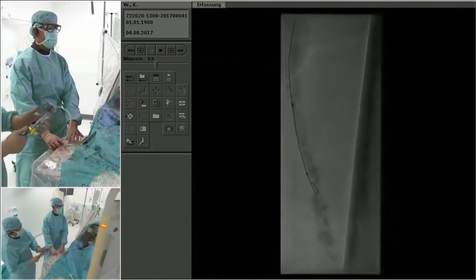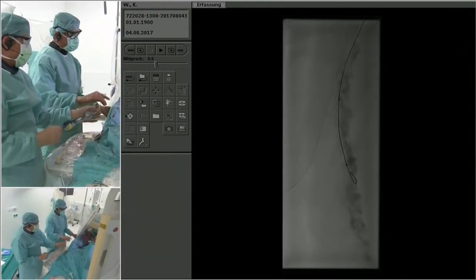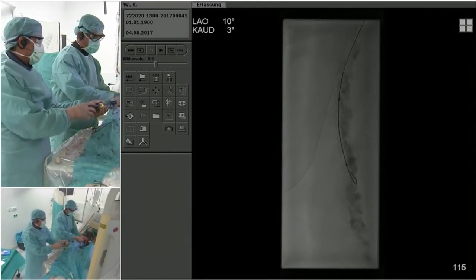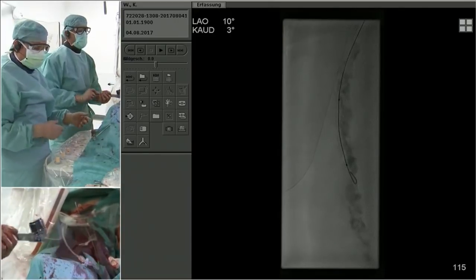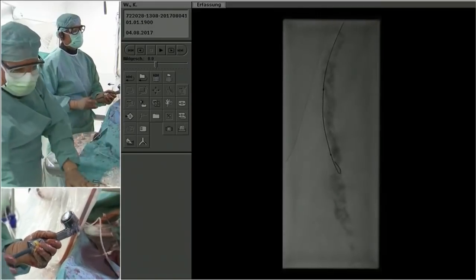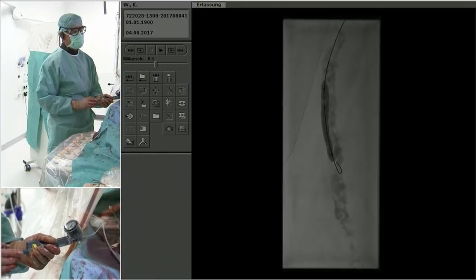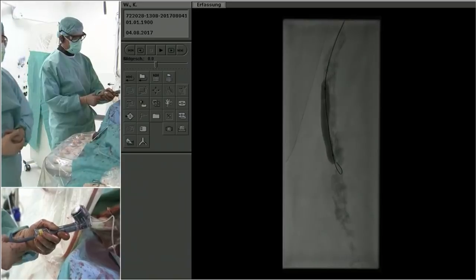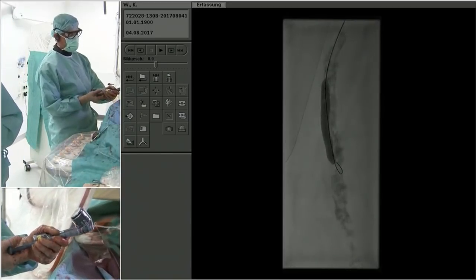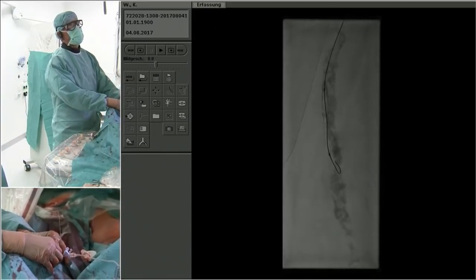In these extremely calcified arteries, I think the risk of perforating at some point is high, and the risk is diminished if you come from both sides, or you can at least solve the problem from the other side if you perforate from one side. But still, we first try a little bit from antegrade, predilate as far as we can go, until we go retrograde. That is also helpful for the retrograde passage when we have predilated the plaque a little already from antegrade. So Khusrow and Christian, any other comments?